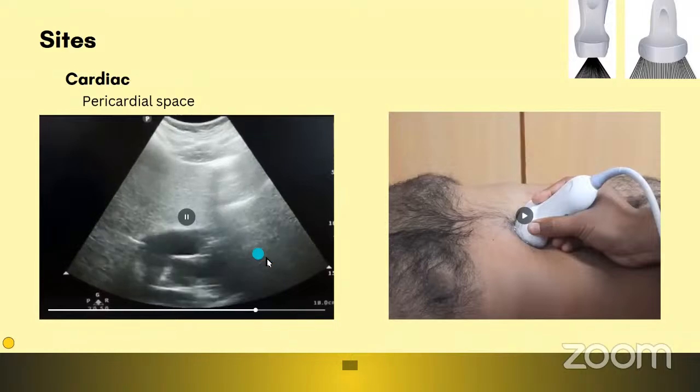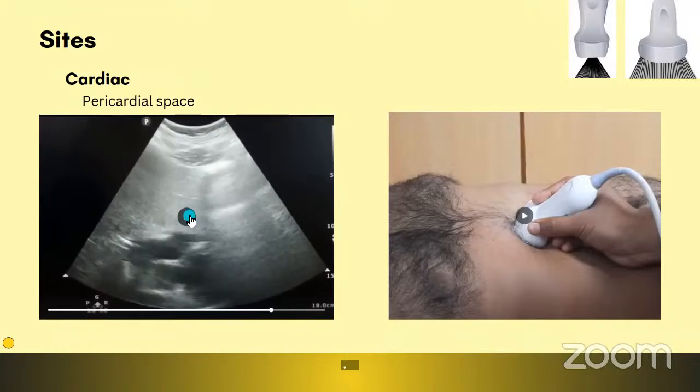The main beauty of ultrasound, as compared to the radiodiagnostic tools which we used in the earlier modules: in the previous ones, we used static images or a series of static images. In chest X-ray, we just had a single image. In CT, we had multiple images, but at one point of time you are just visualizing a single image, and then scrolling down to imagine the 3D structure of the lesion you are dealing with.